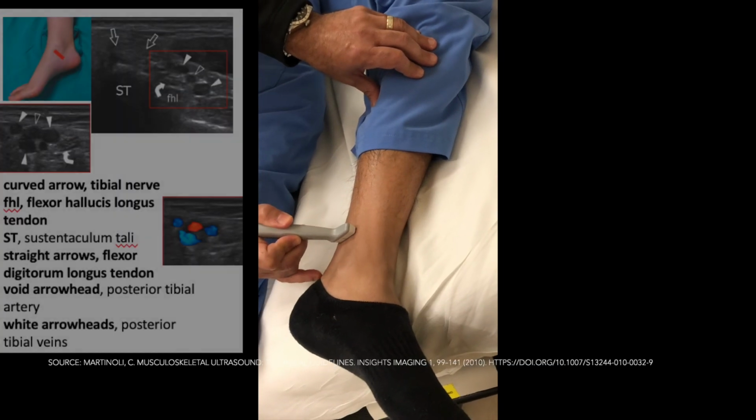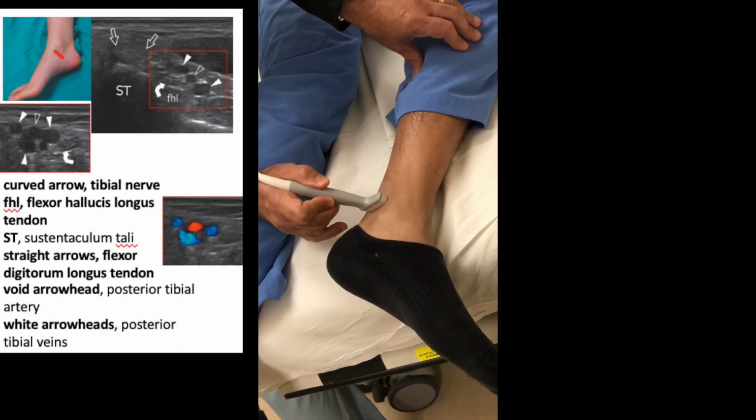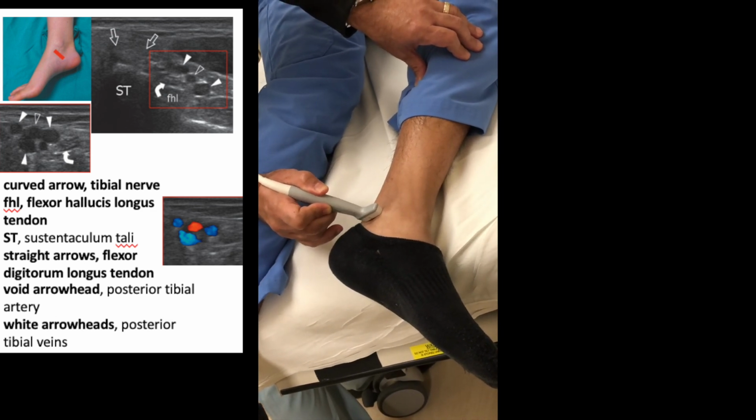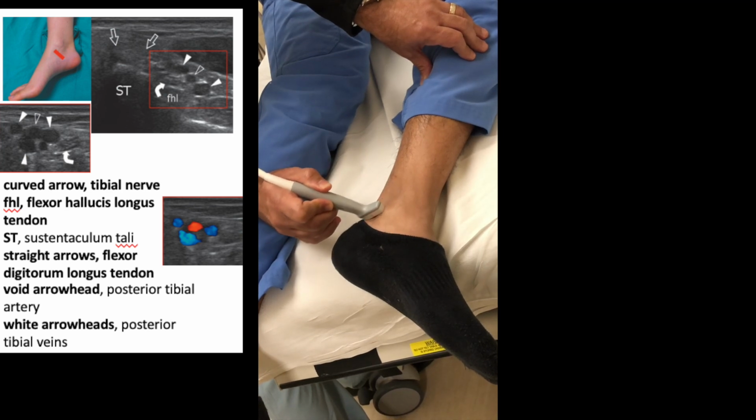The posterior tibial neurovascular bundle, including the tibial nerve, the posterior tibial artery, and veins, can be seen at the level of the tarsal tunnel. And we can evaluate for any masses.